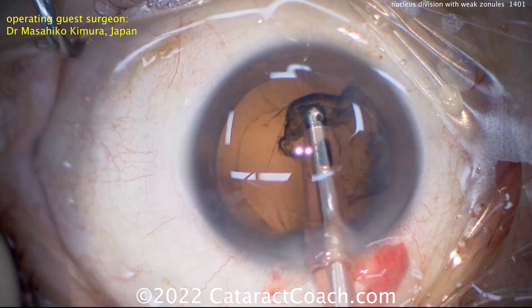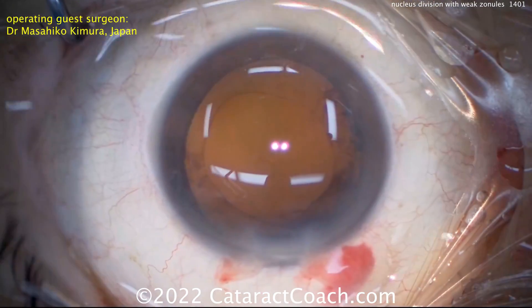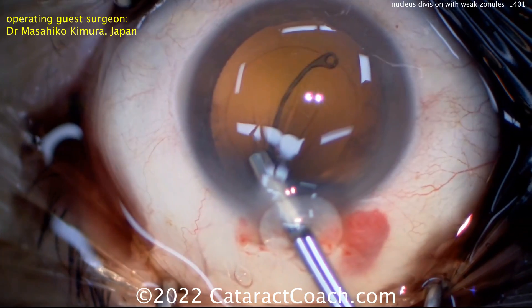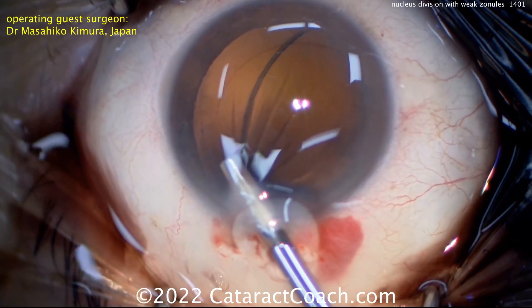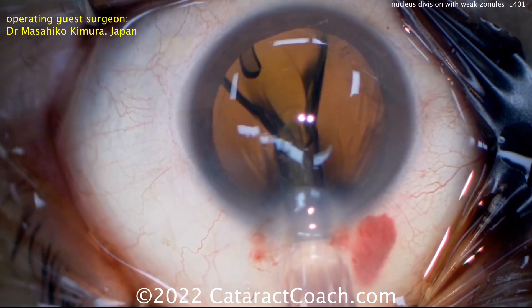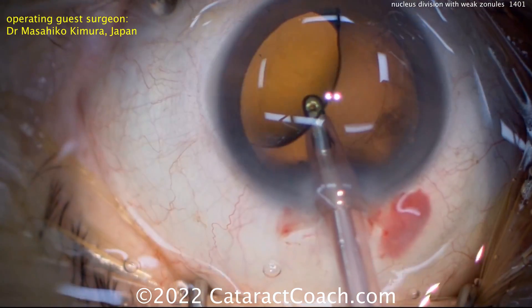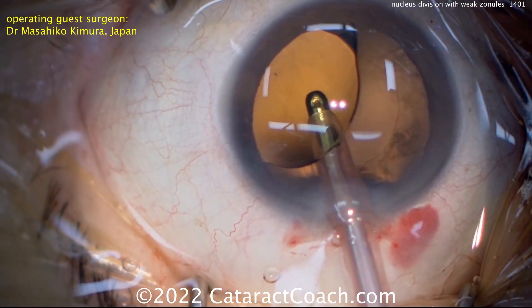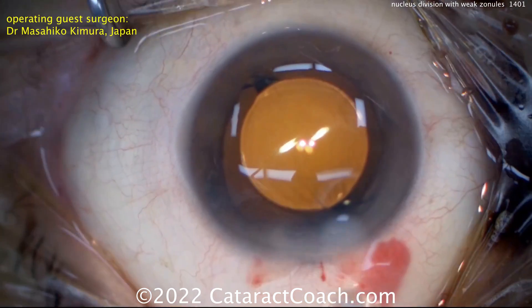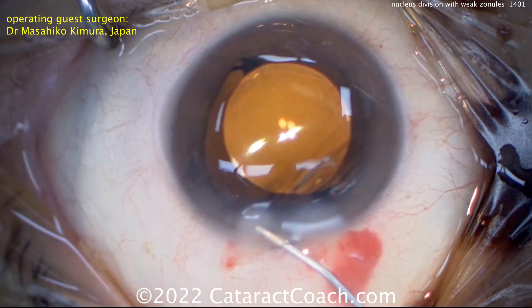You can see here at the end of his case, as he's removing cortex — smart move going in slow motion to avoid damaging any more zonular support. And here comes the capsular tension ring being injected into the capsular bag, nice and easy, good delivery. Then the single-piece acrylic lens can be placed in the capsular bag as well. A very nice technique — if you have a case with loose zonules, perhaps give one of these techniques a try. Thanks, Dr. Kimura, for sharing your videos.